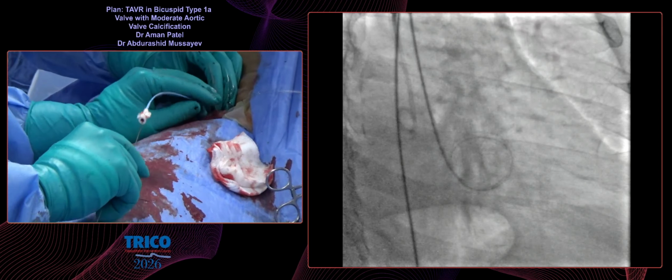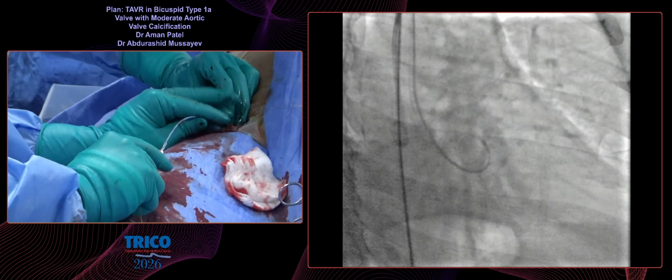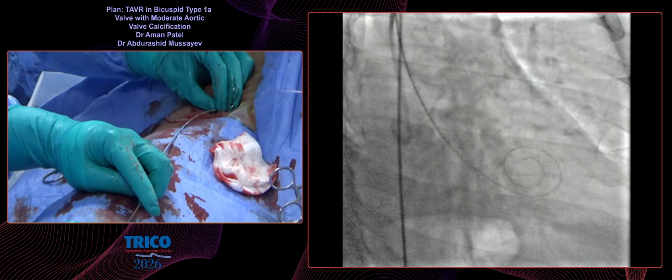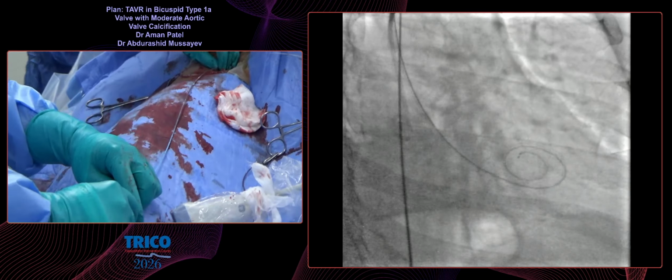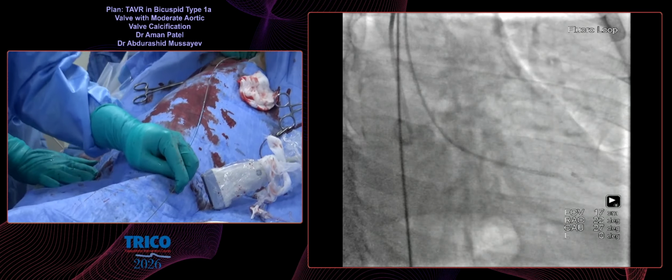It's funny, Aman, as you said that we don't have transesophageal, because in 2014 when we started doing the valve, we were like 15 people in the room. And we're doing all sorts of things, and you're showing here something completely different, minimally invasive, only 2 arterial access. Yes, I fully agree.